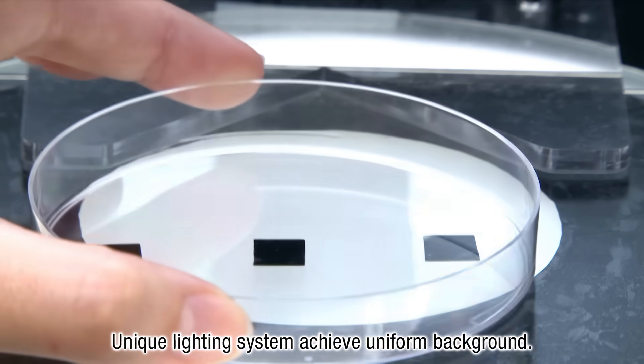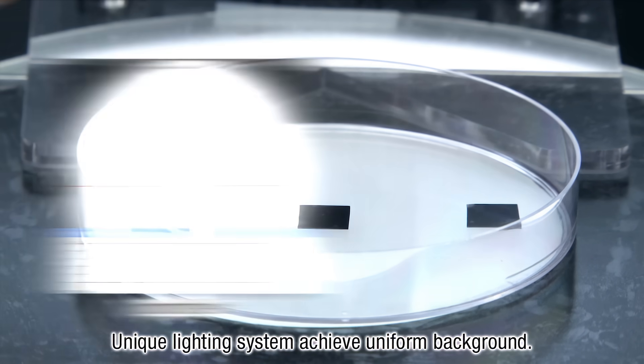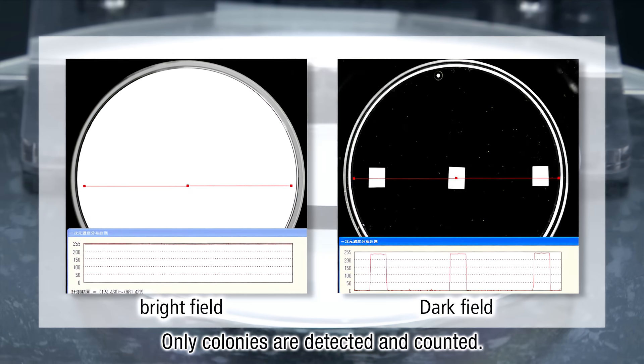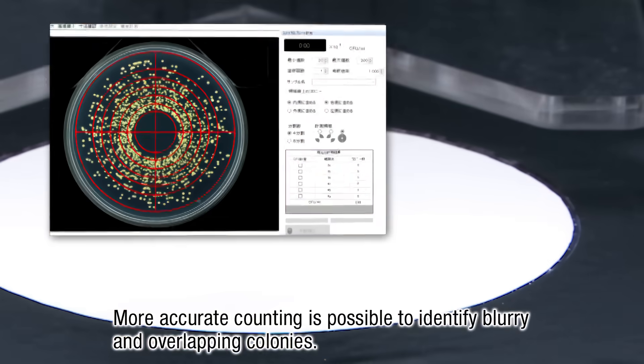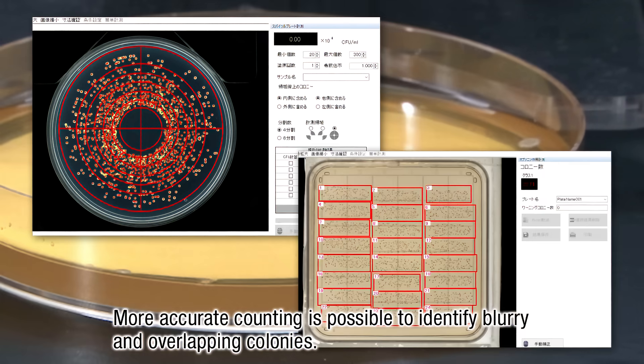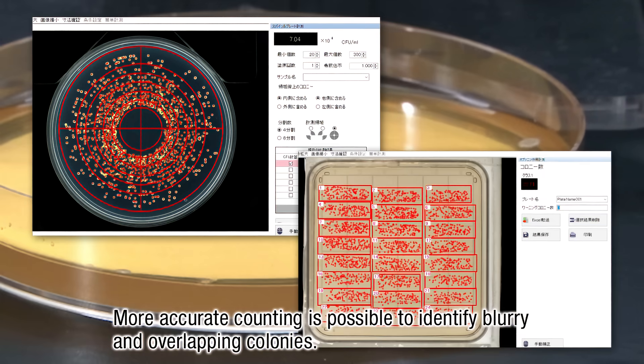More accurately, unique lighting system achieves uniform background. Only colonies are detected and counted. More accurate counting is possible to identify blurry and overlapping colonies.